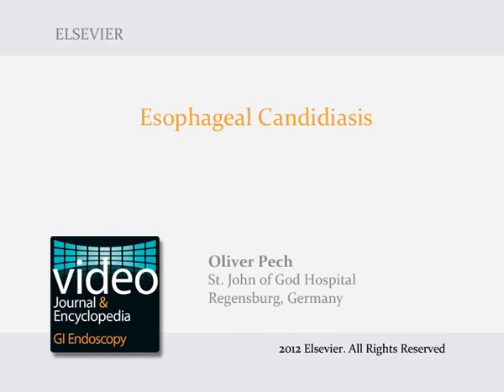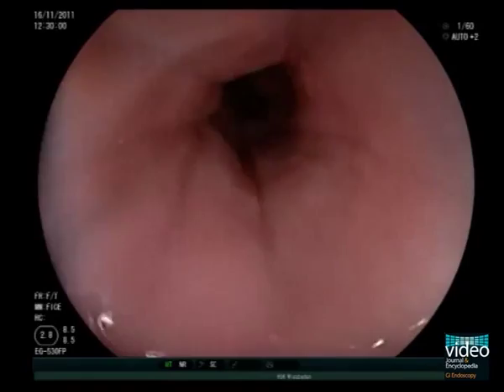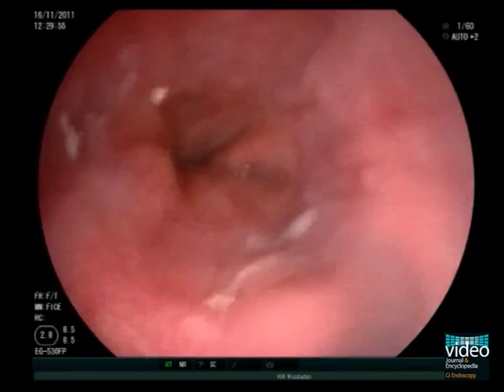This is a patient referred for upper endoscopy because of dysphagia. The patient's medical history reveals COPD with the use of inhaled corticosteroids.